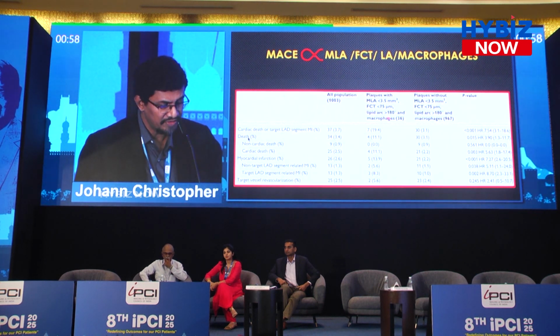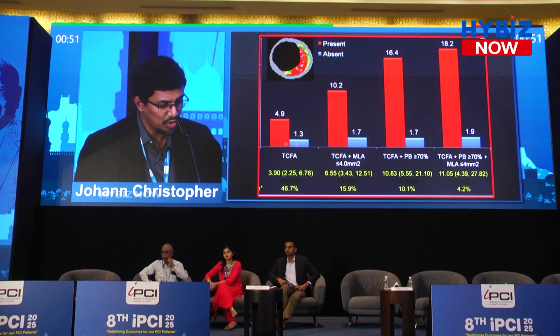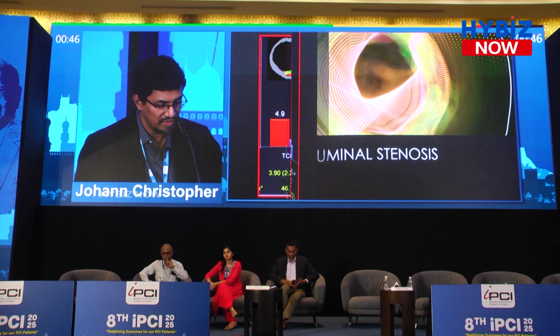We know that the features are important, so when you have these high-risk features, your MACE events go up compared to patients who don't have them, and the more vulnerability features a plaque has, the more events you have, and that is again clear.